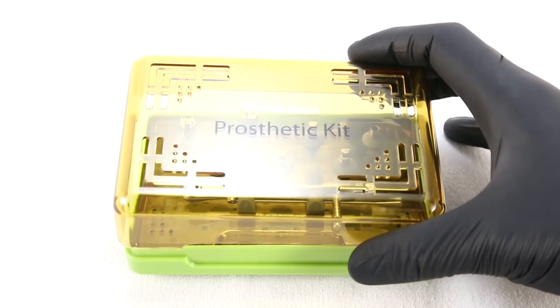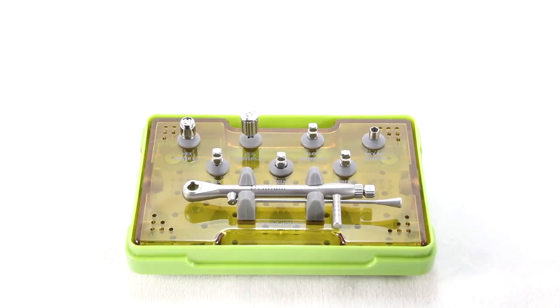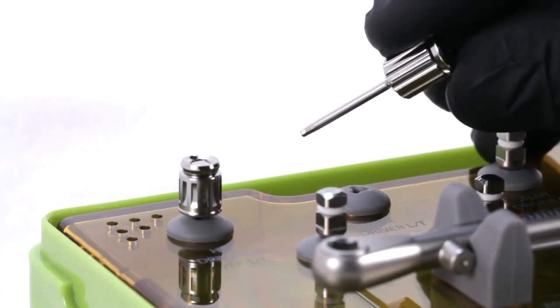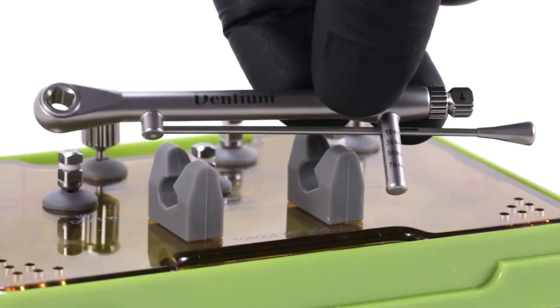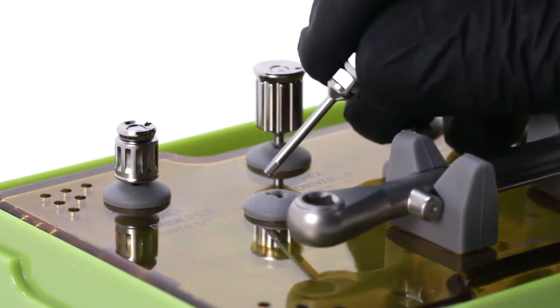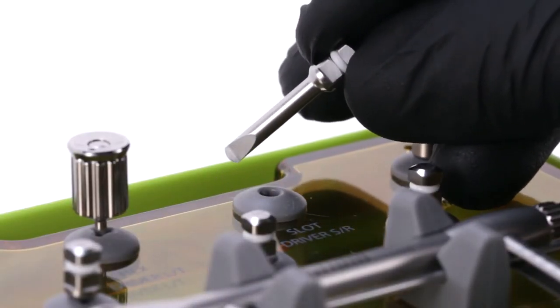Open the Dentium Prosthetic Kit. The restorative clinician may need to utilize the following instruments to take a bone level implant impression: the hexed prosthetic drivers, which are handheld, with a tall version and a short version; the torque wrench; the hex driver for use in the torque wrench; and the slot driver, also for use in the torque wrench.